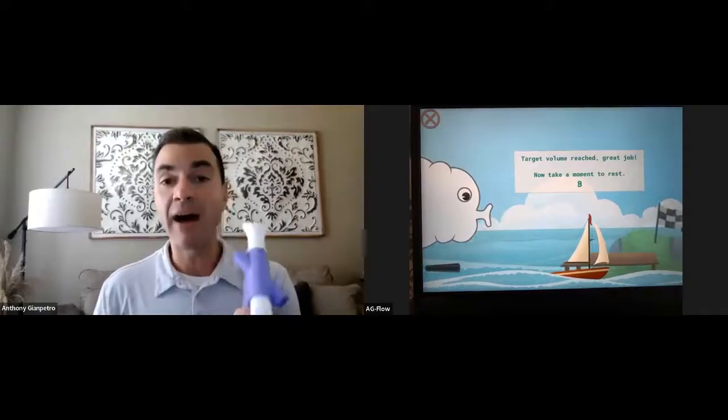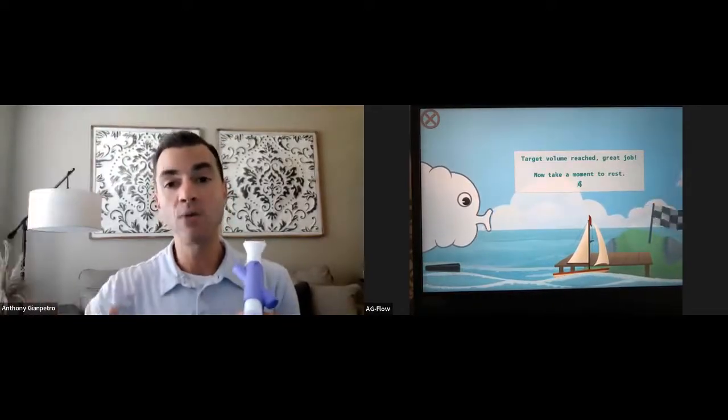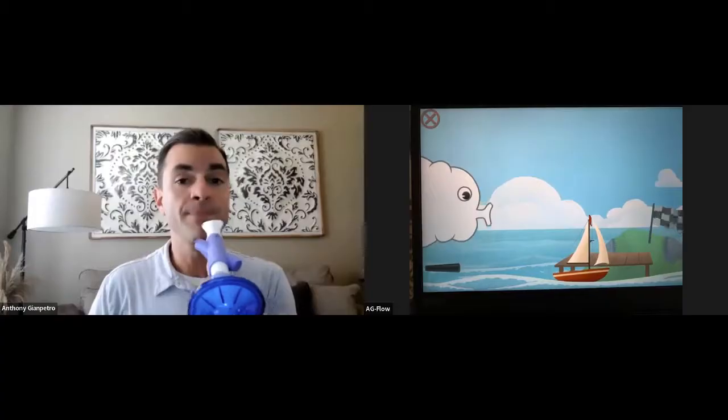See, I did it. And that volume was appropriate for me. See that nice little checkered flag, and it gives you a countdown. You can change that countdown if needed to challenge your patient more, but that looked like a good one for me, so I'm going to go ahead with another set.